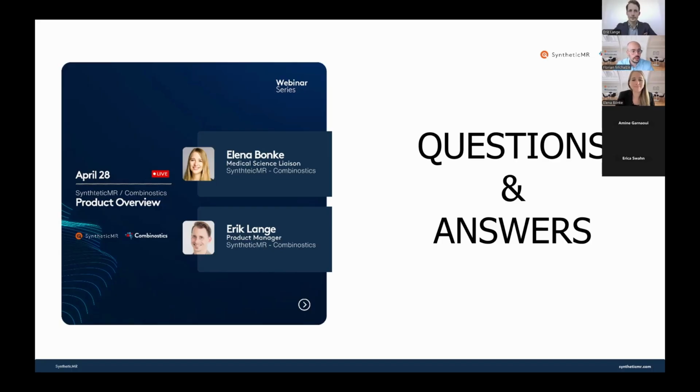Thank you. And Elena, how does that look with SyMRI? Yeah, very similar, I would say. So you can also configure the outputs on what you want to receive back to your PACS. I think especially for SyMRI, this is very important. You saw all the different reports that we can generate. And of course, you don't want to have all these different reports for every single clinical case in your PACS. I mean, if you're, for example, following up with a multiple sclerosis patient, you don't want to see the dementia report in PACS, to not confuse the patient, to not confuse the referring neurologist.